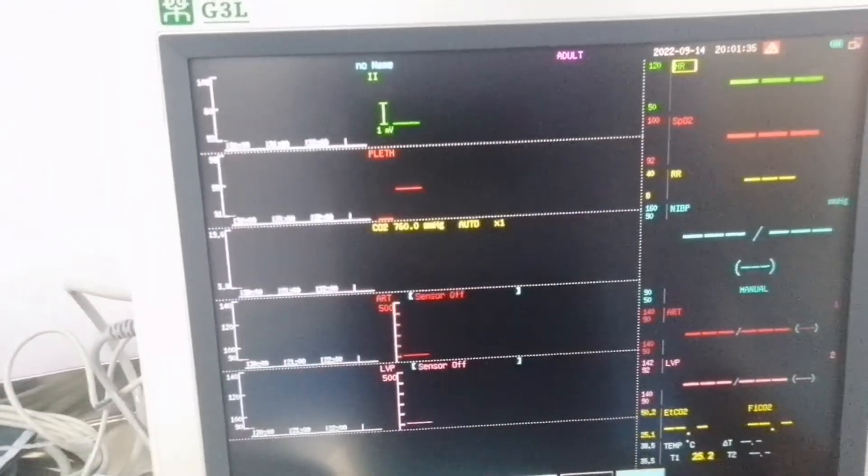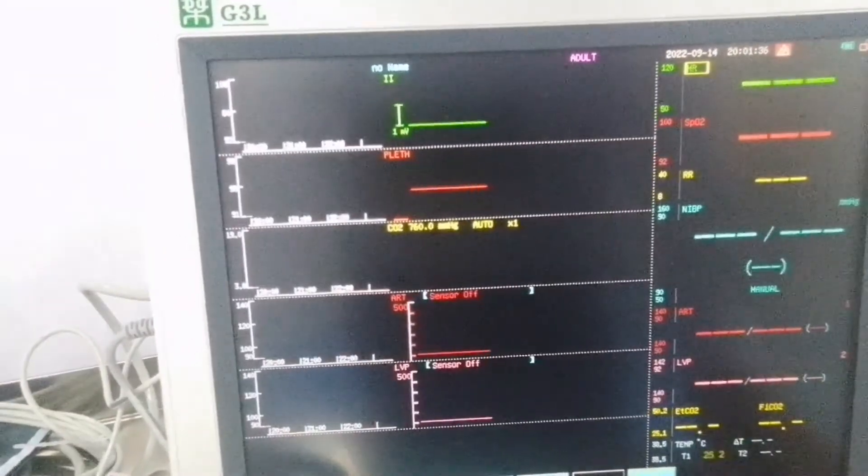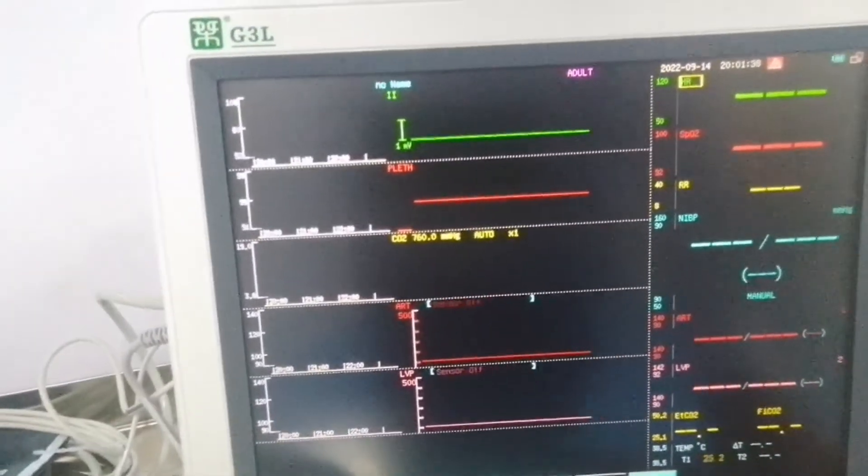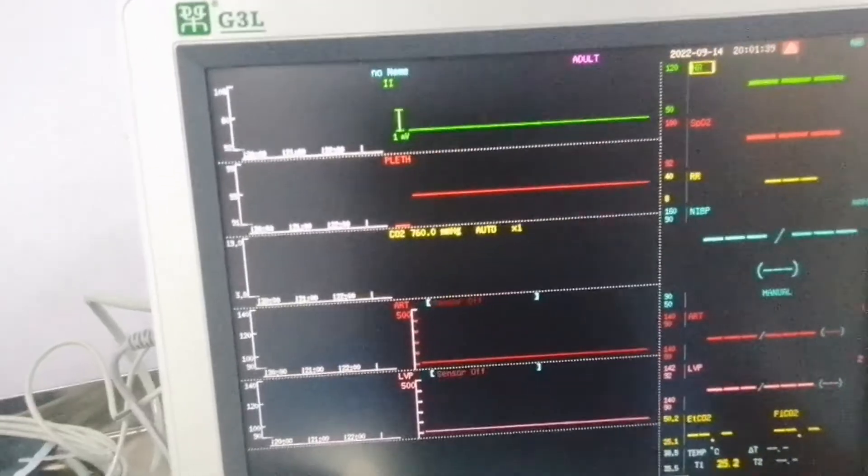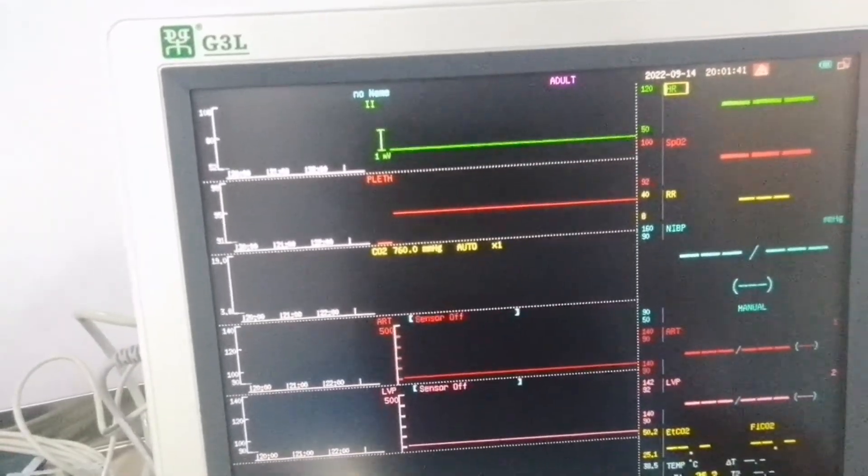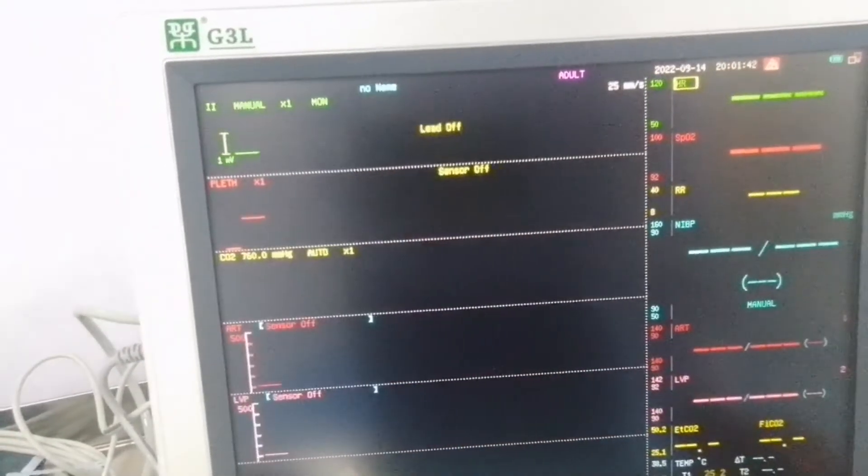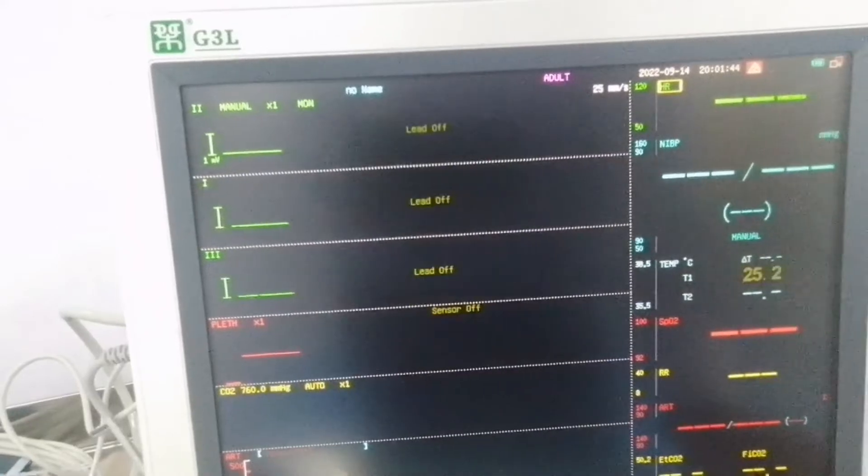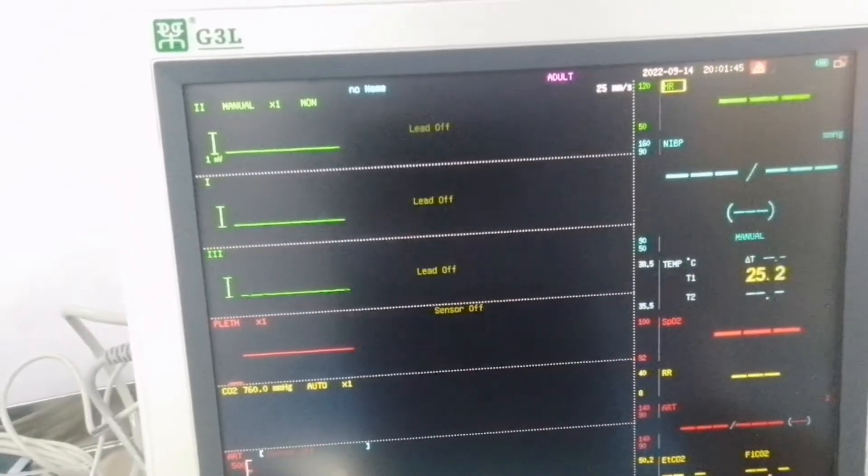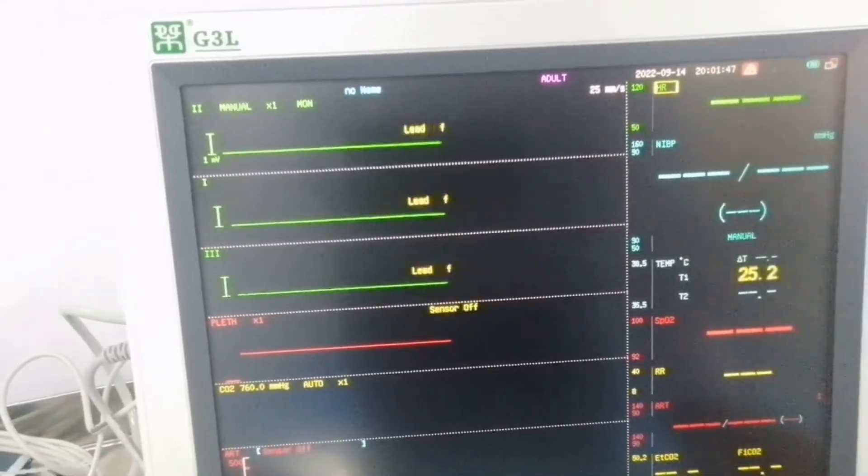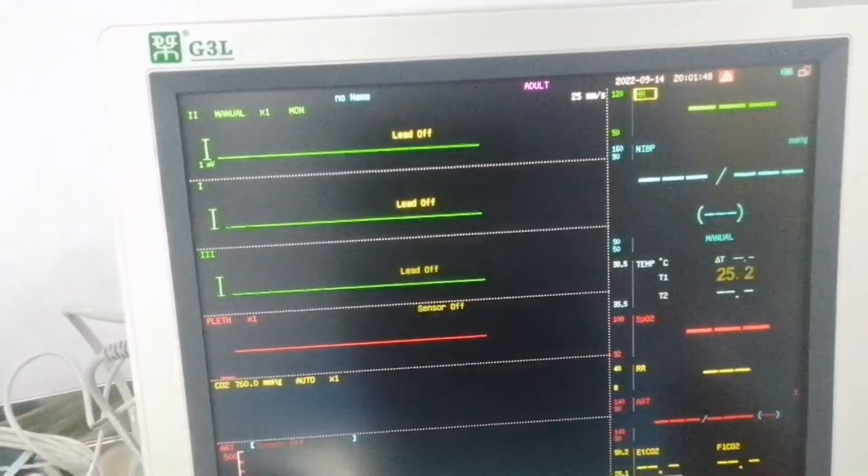Huge digit means all parameters numeric display will be huge. And same with mini trends, all parameters and waveforms will be in mini trend shape. So we will go to 1 ECG or 3 ECG according to our requirement. So this is the main function of the display setting.